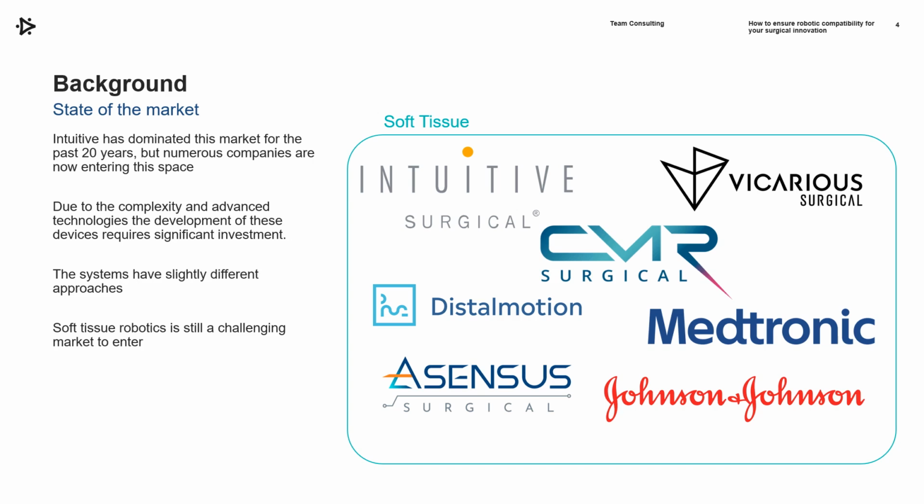There are also some systems out there where the surgeon is remote or semi-remote, but not within the sterile field. And some other systems that are coming in as well now, looking at having the surgeon on the console still scrubbed in and essentially in the sterile field, so you could switch between the robotic control or manual.